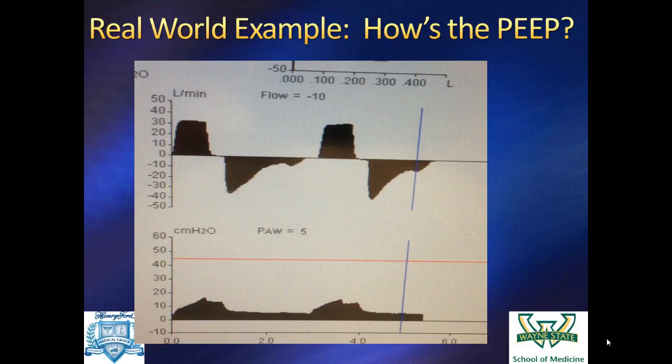And as I'm happy to point out, although I love to do stress index, I do it at 9 o'clock when I'm on rounds, and nobody does it for 24 hours. How do I know that the PEEP I picked at 9 o'clock is good at 9:30? So that's the problem with this, but it's fun to do physiology at the bedside, so it's fun to do.